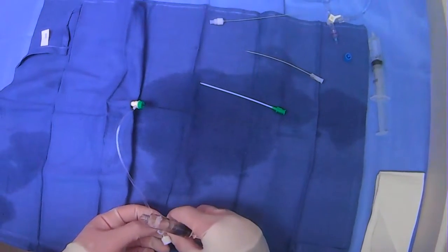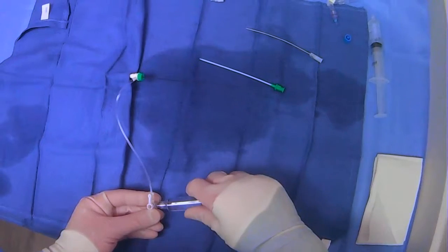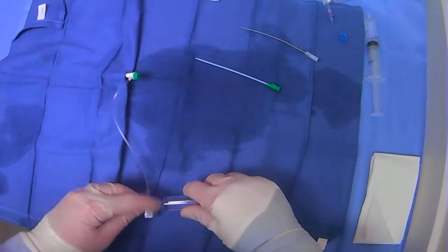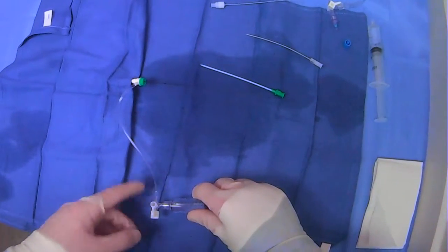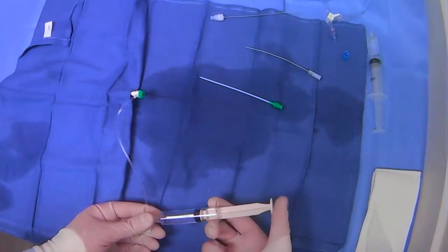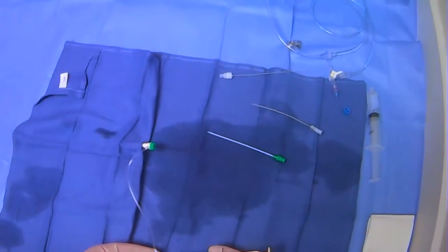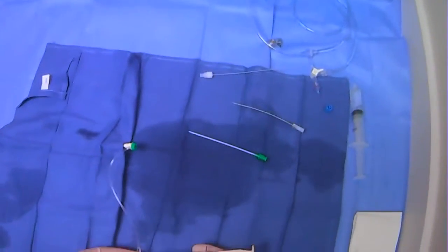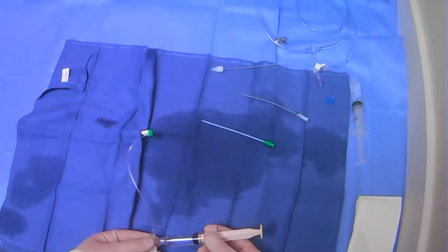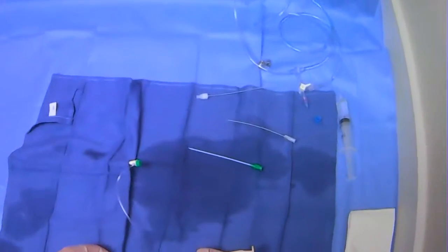What we can do now is hook up our contrast here, open up the back end — this is closed — and we can inject contrast. If we were doing fluoro, we would see where the contrast was going. We can now do some runs with contrast to see what's going on with where we put the sheath in.